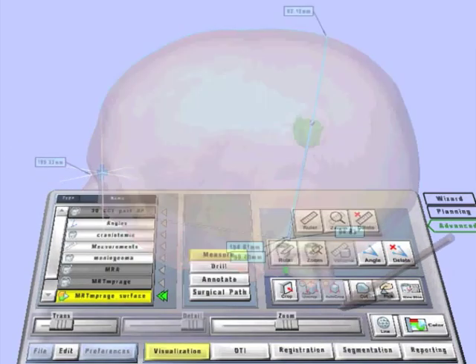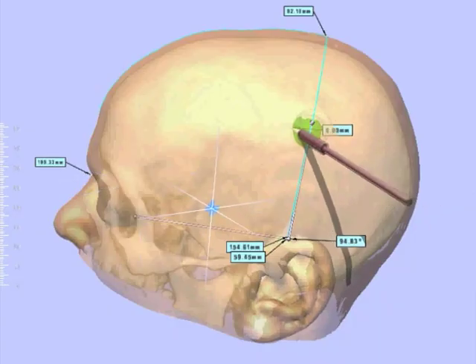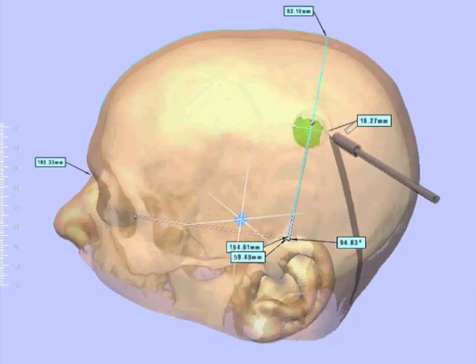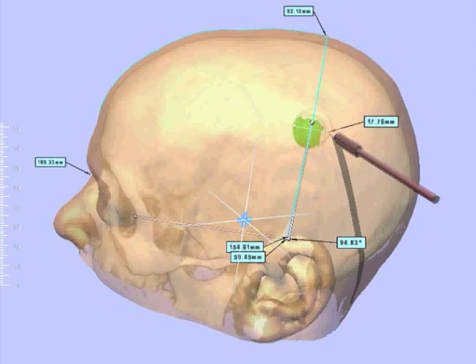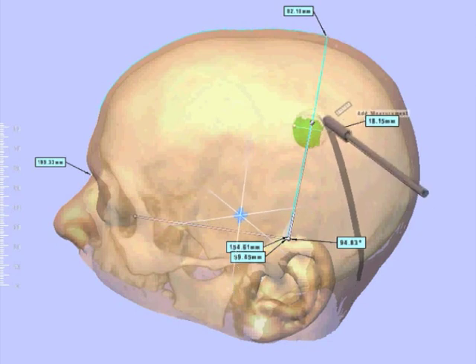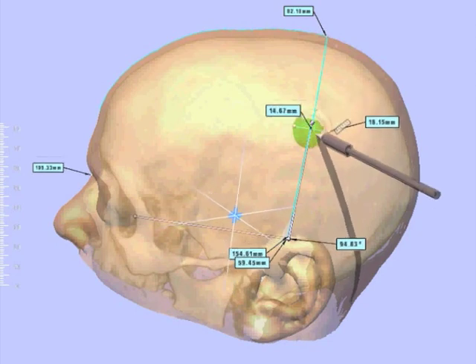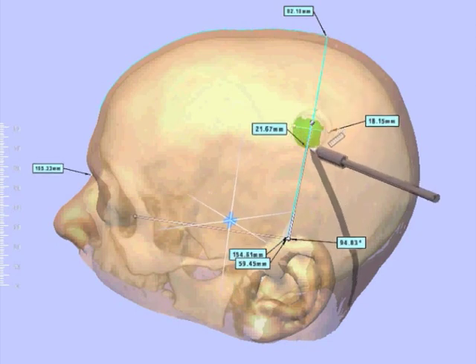Finally, by using the straight ruler, we are able to measure the anterior-posterior and the craniocaudal extension of the craniotomy.